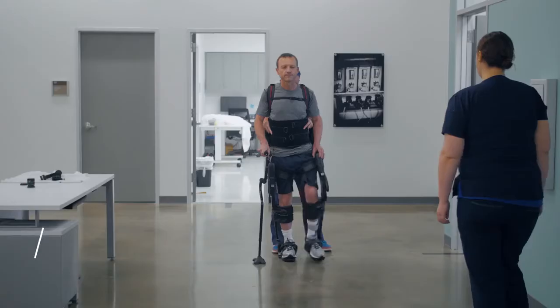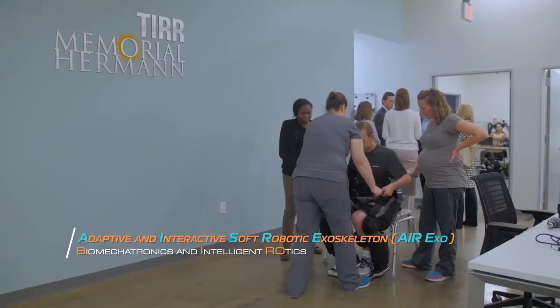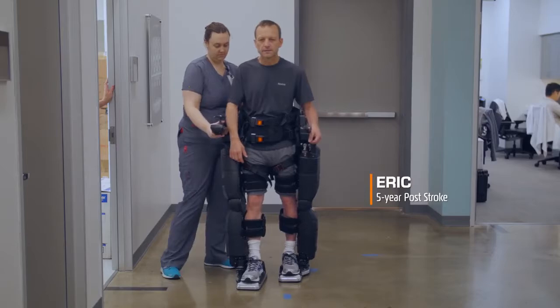At the Center for Wearable Exoskeletons here at TIRR Memorial Hermann and the University of Texas in Houston, we do a lot of studies using different lower limb exoskeletons and robots.